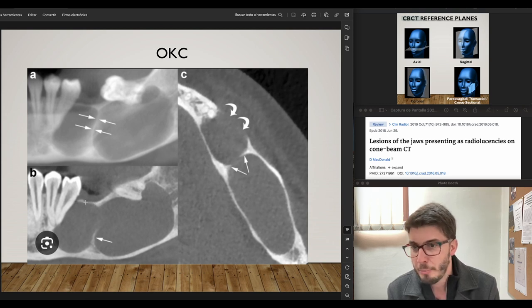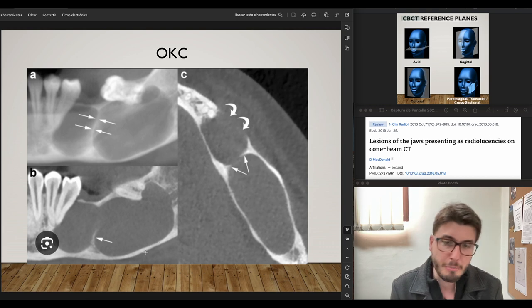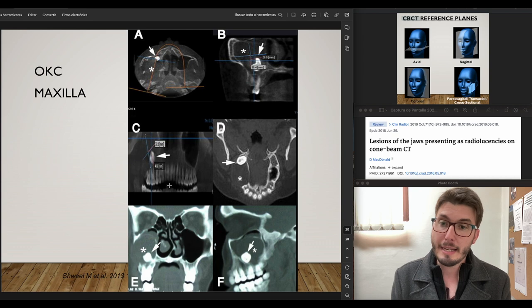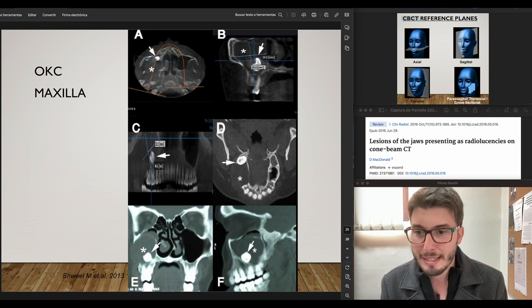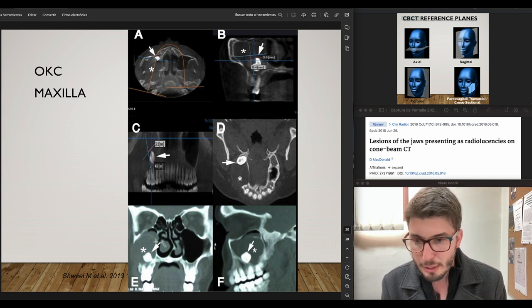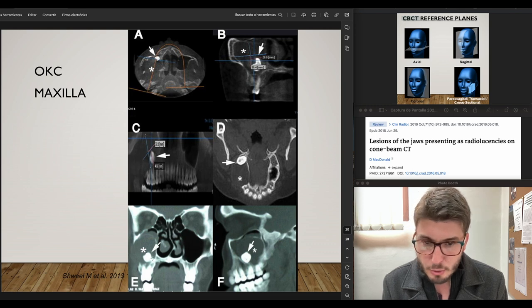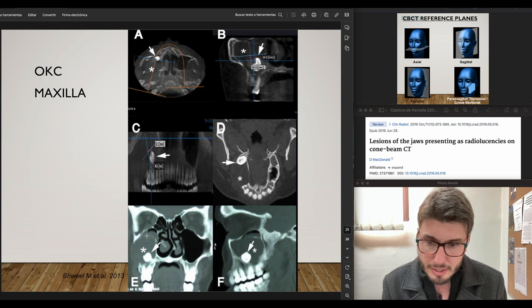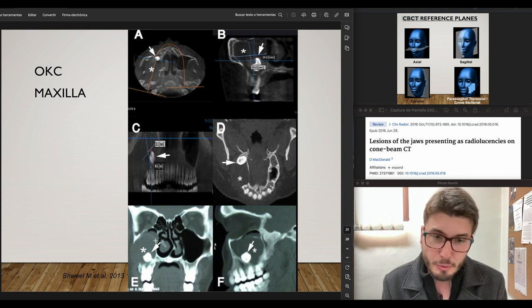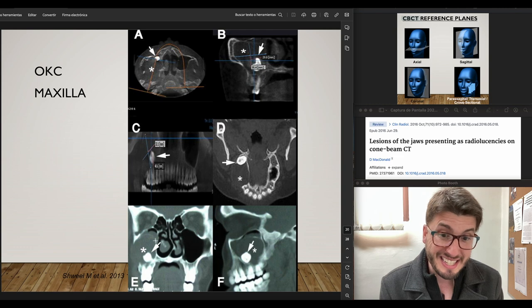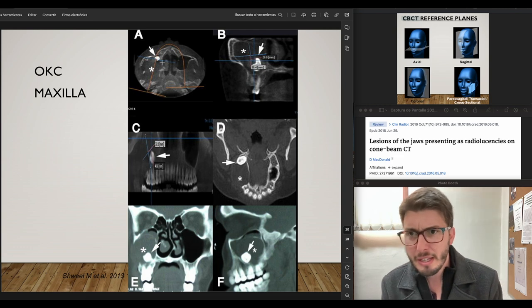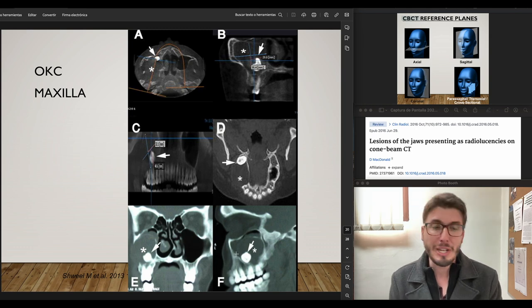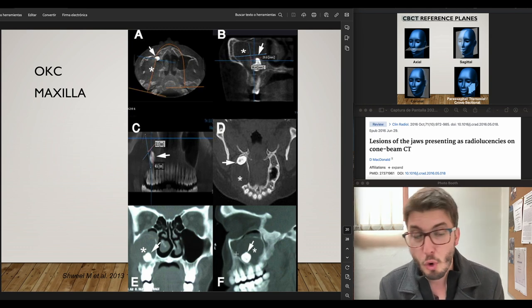The lesion extends upward to the alveolar crest and downward to the base of the mandible. In the maxilla, an OKC can have a different appearance because the sinus gets inflamed as well, making the lesion — which is radiolucent — appear slightly more radiopaque relative to the radiolucency of the sinus. It can also be associated with an impacted tooth.